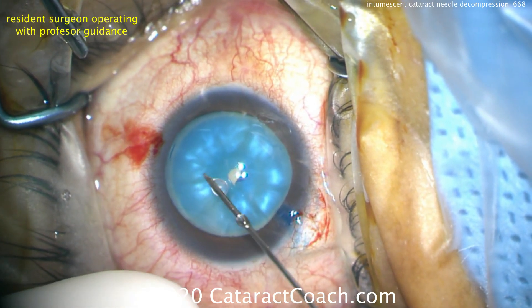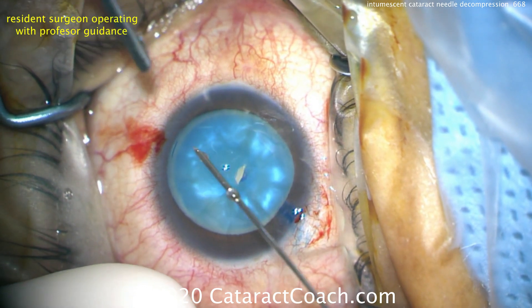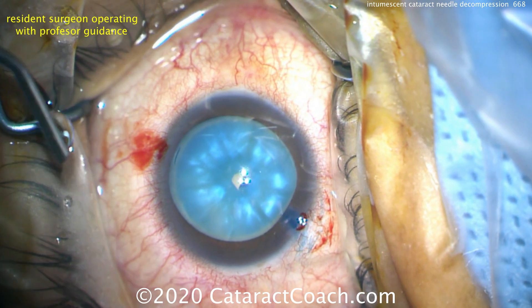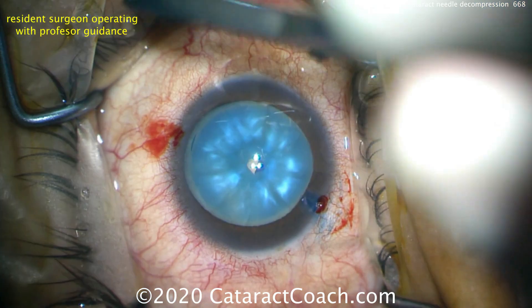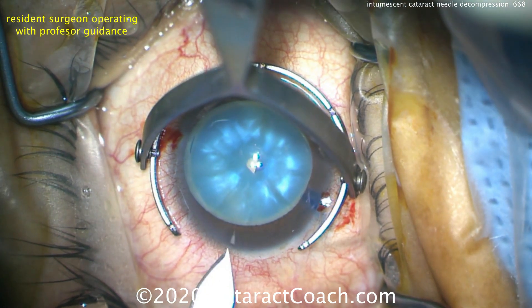The nucleus can be rocked a little bit and you'll see a lot of the intumescent fluid that comes out — this is the fluid aspirated from the capsular bag. After washing that off, the resident is going to complete a capsulorhexis now that the capsular bag has been decompressed.